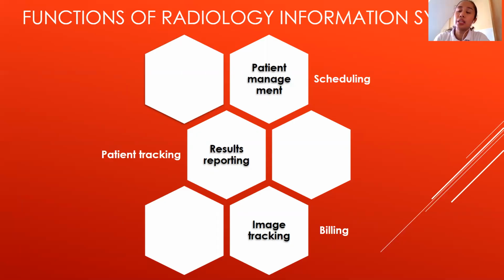So class, actually there are scale. So some hospitals, many hospitals class have limited resources. You only have 1 x-ray or 2 x-ray. You only have few radio technologists. And you have to bring the patient inside the x-ray room. So that to facilitate their scheduling, diba? We need an information system. And to make sure that we got the specification of the doctor correctly, then we should be assisted by your radiology information system.